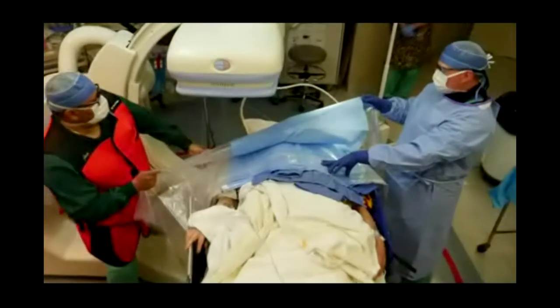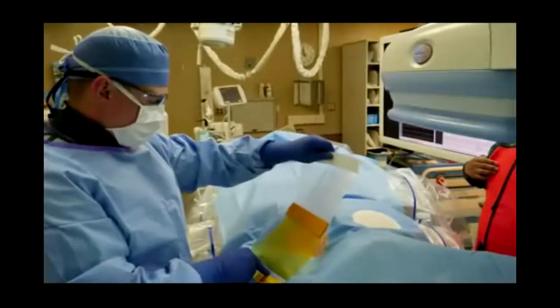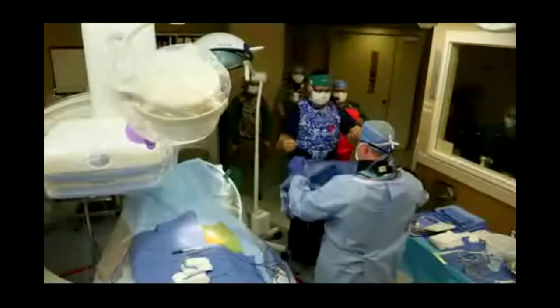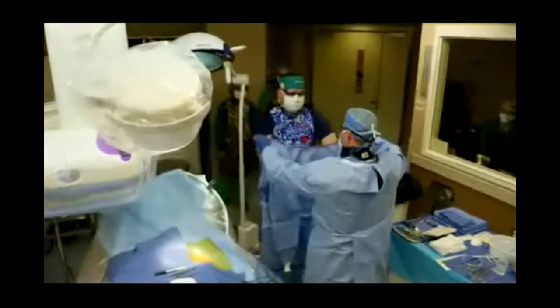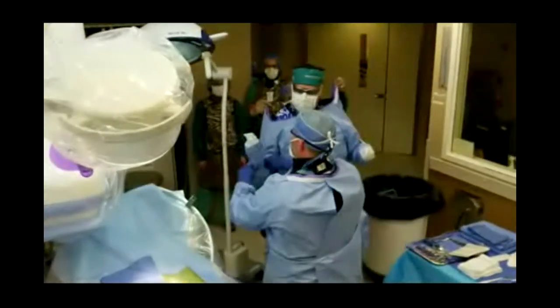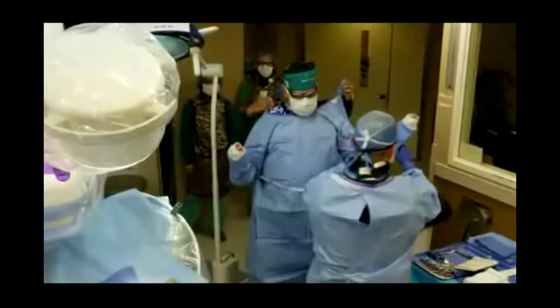Implanting an ICD is procedurally like implanting a pacemaker. We start with a sterile drape over the patient. We apply an Ioban patch for total sterility over the exposed skin. I then come in after completing a sterile scrub, gown, and gloves. We use a double glove technique to minimize any chance whatsoever of introducing an infection.